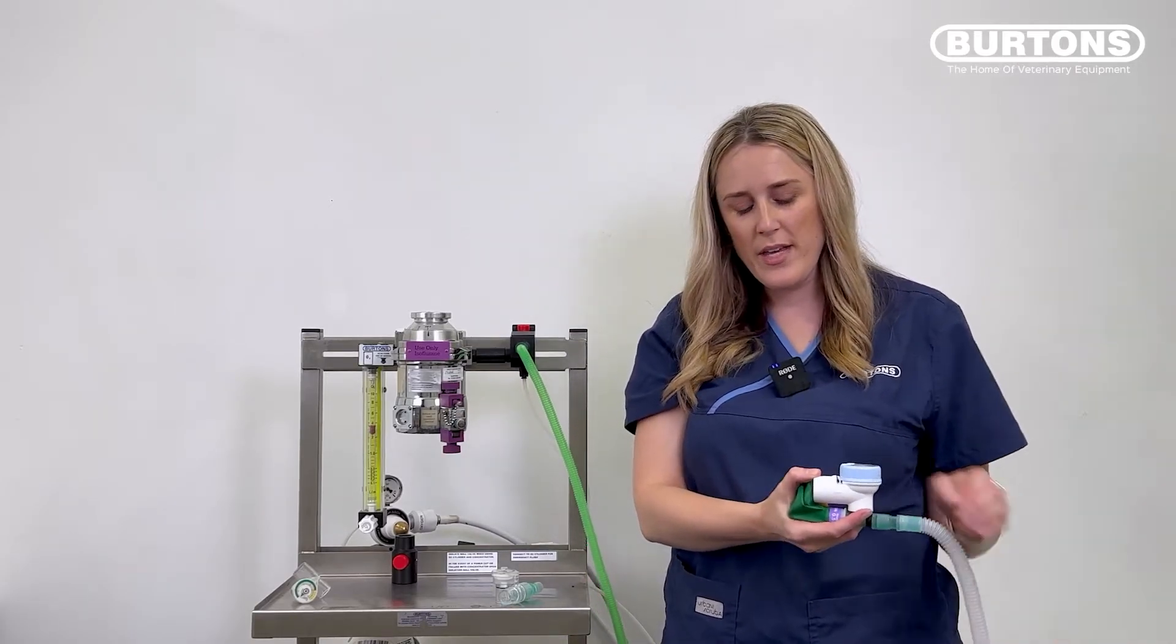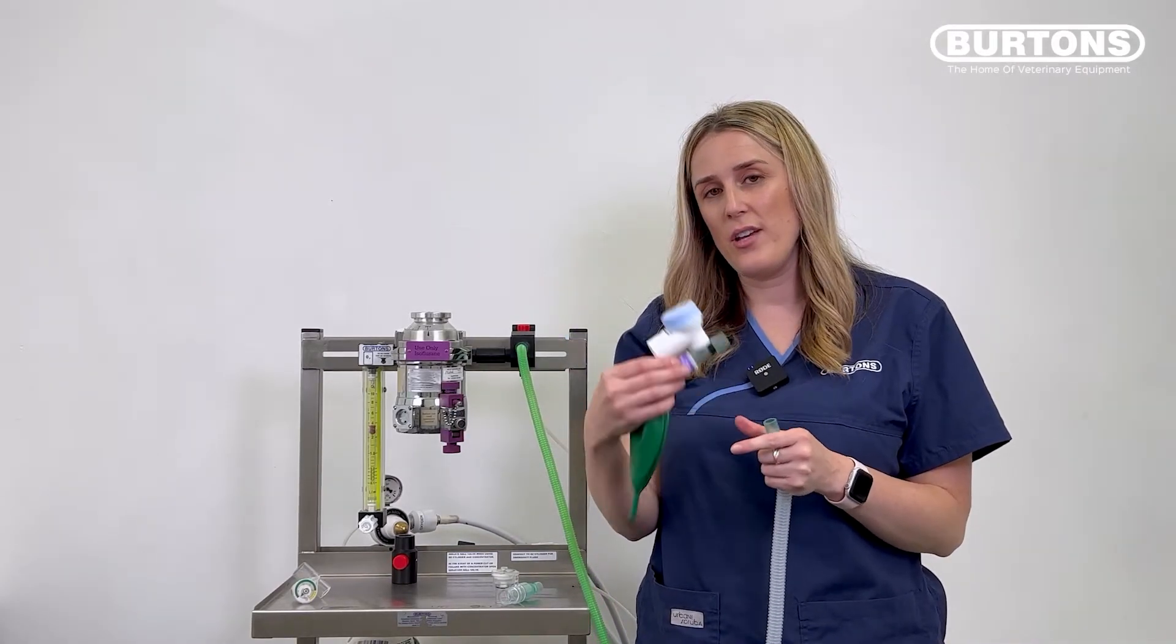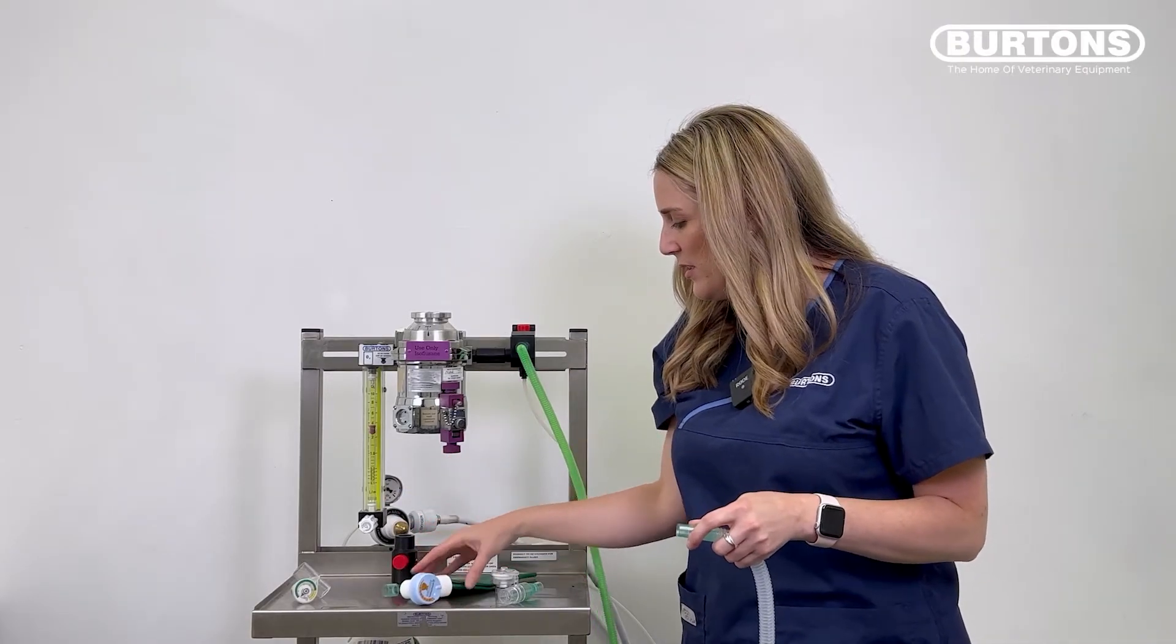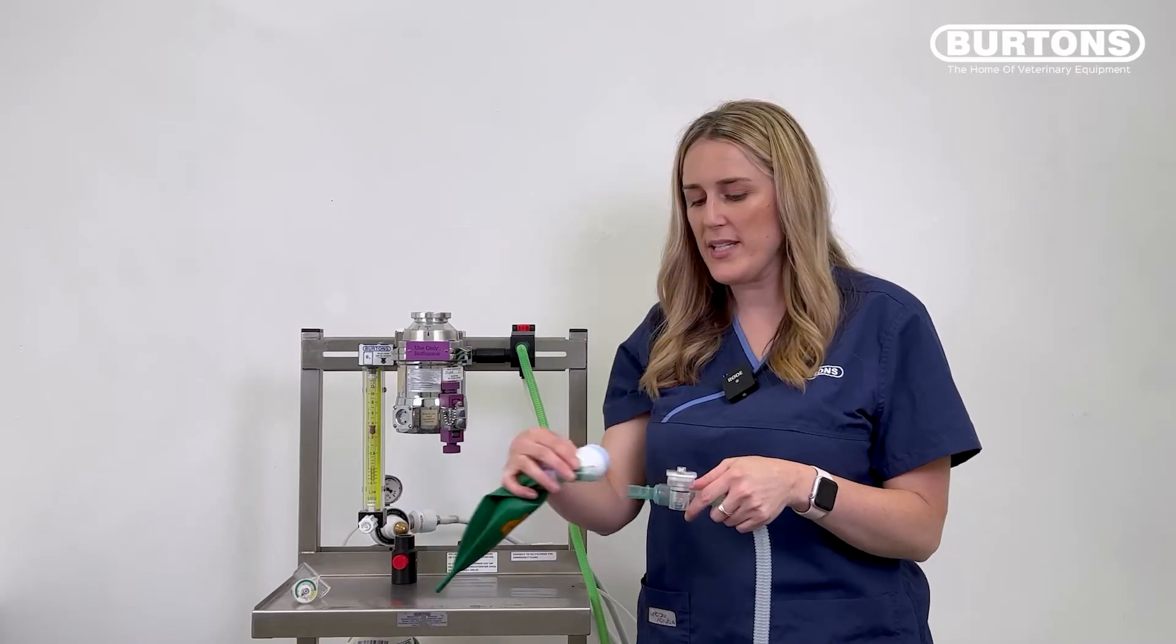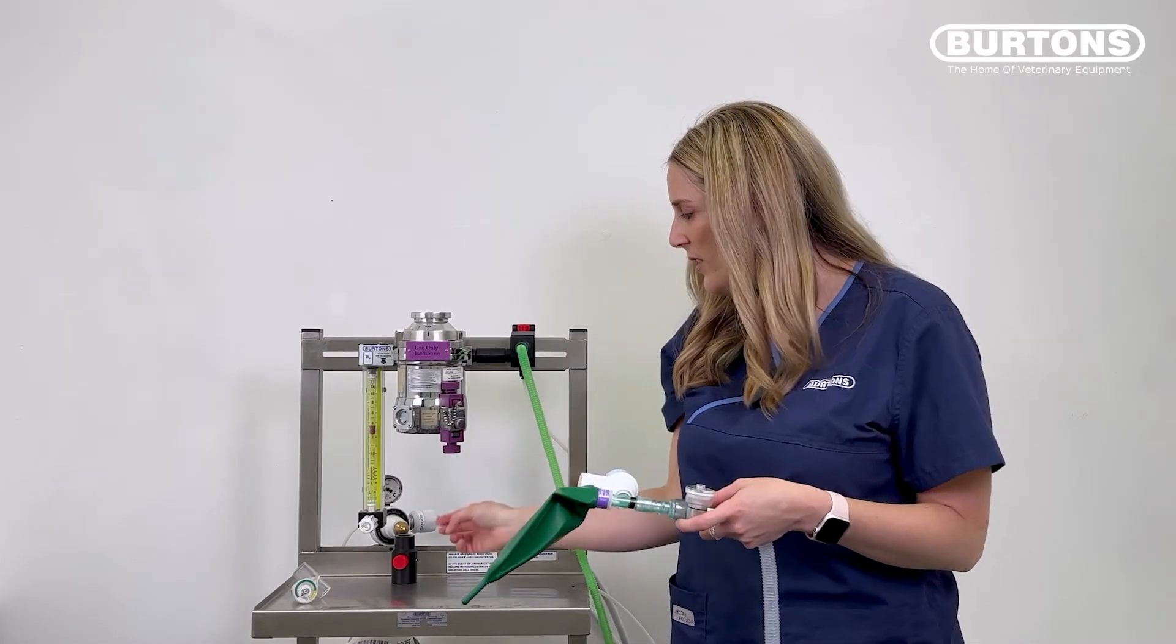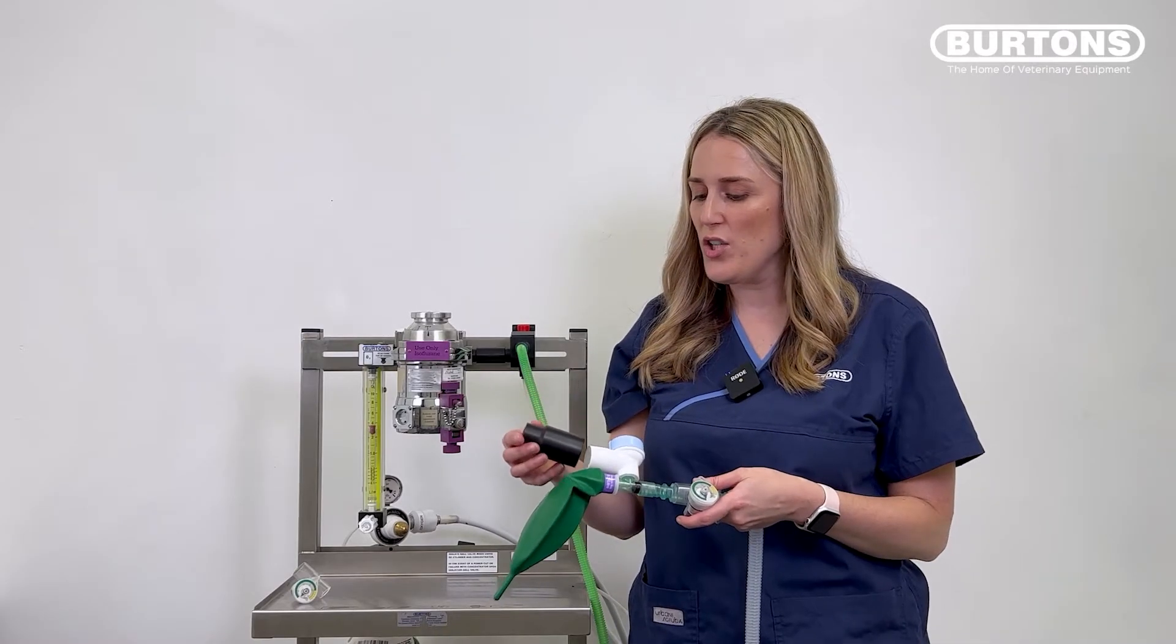Okay, so with our expiratory limb, if we just take off the entire scavenging unit and APL valve, we can then attach our manometer directly and then put it all back together again. We can then also add our IPPV valve button onto our scavenging system.